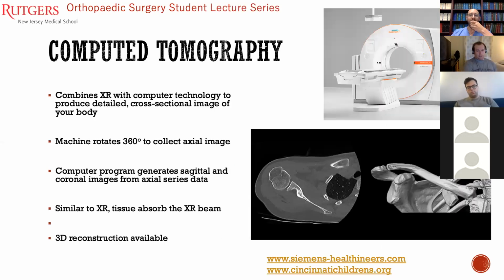We're moving on to the next modality, looking at computed tomography. Basically, this is a series of X-rays that are done in the axial plane. The machine itself spins around to get a complete cross-sectional image of the area in question. As the machine rotates and collects all the images, the axial cuts are used to reformat to make the sagittal and coronal cuts.